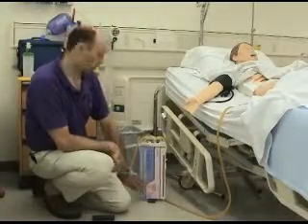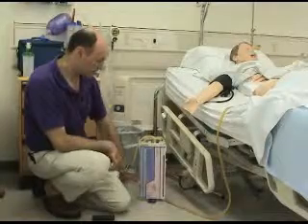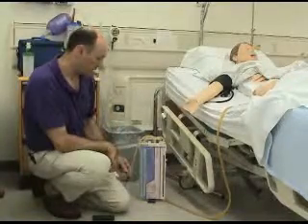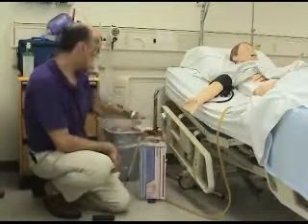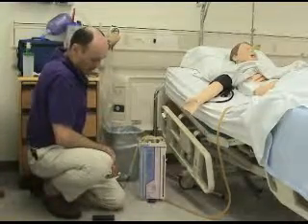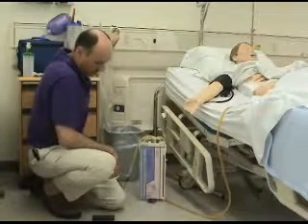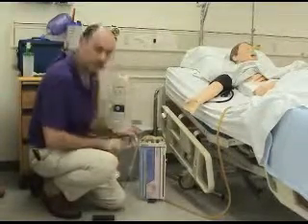The other thing you would expect the students to identify is that there's too much bubbling in this wet suction. So you would want them to turn the level of suction down to just a gentle bubbling so that it isn't quite as vigorous as it was when they first came into the room.